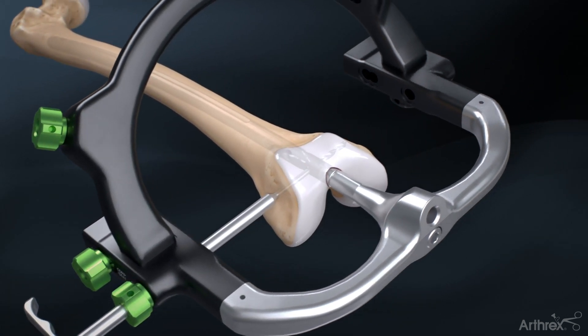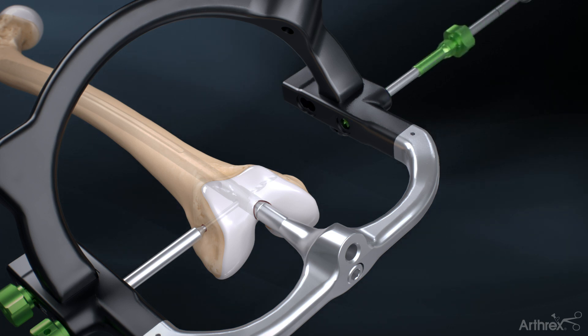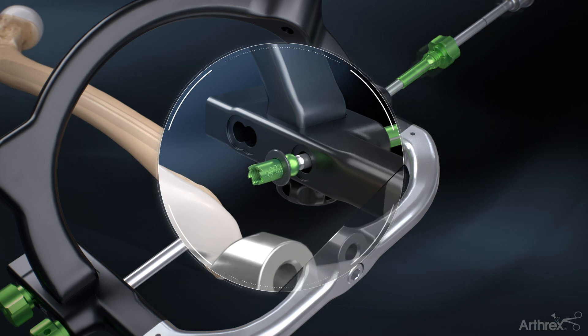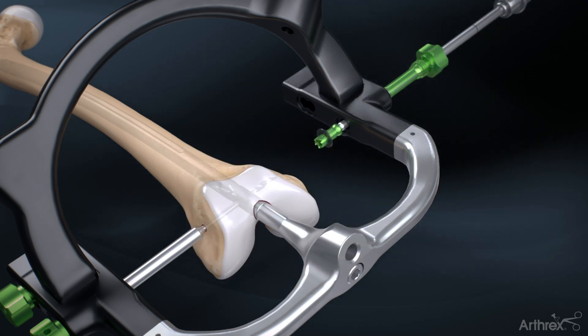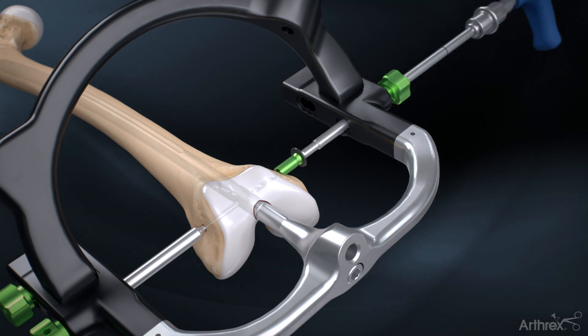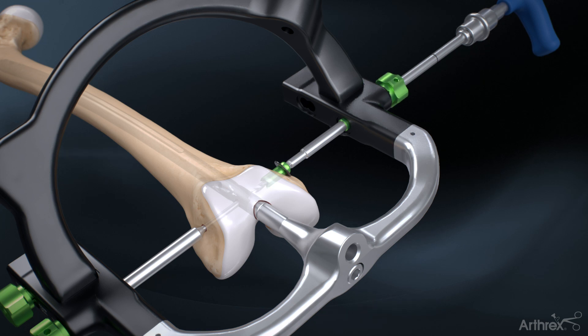Do not remove the drill. Assemble the condylar nut, hex driver and condyle locking collet. A washer must be added to the condylar nut on the inside of the targeting guide. Drive the condylar nut through the femoral cortex and over the drill bit until the condyle locking collet is snug in the targeting guide.